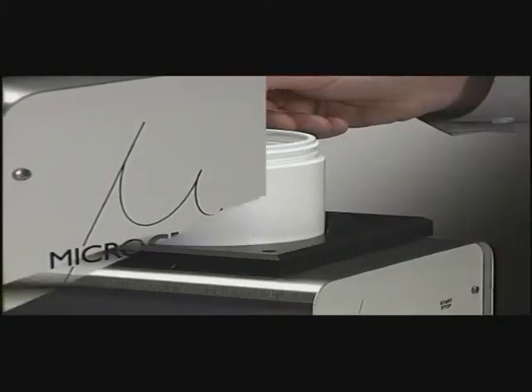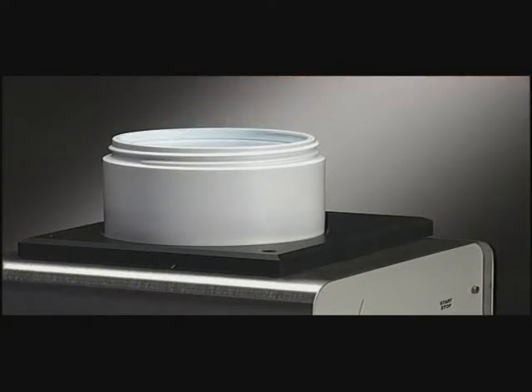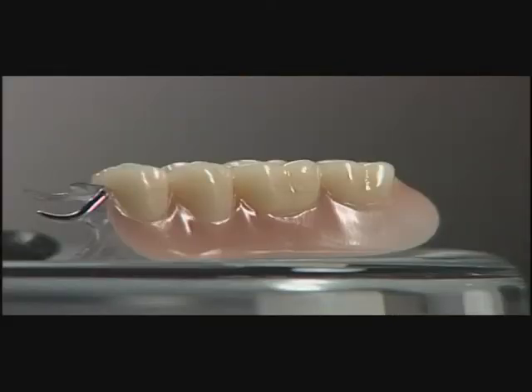After 30 to 45 minutes, the result is amazing. Tartar, nicotine, tar, and every other conceivable kind of deposit on dentures have been completely removed.